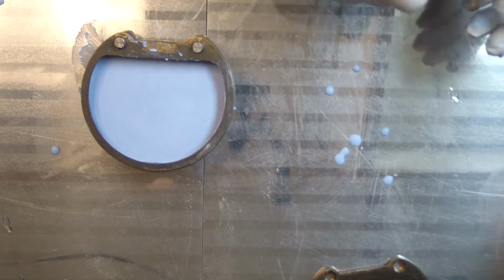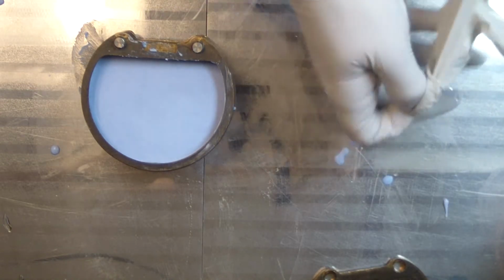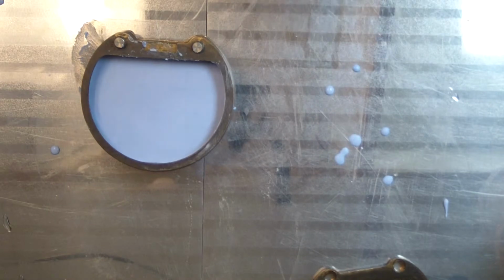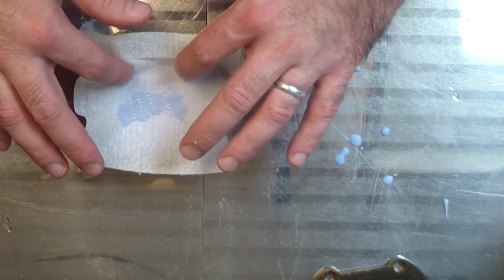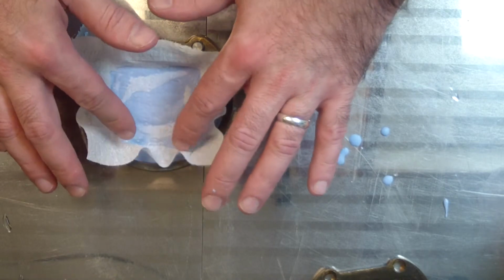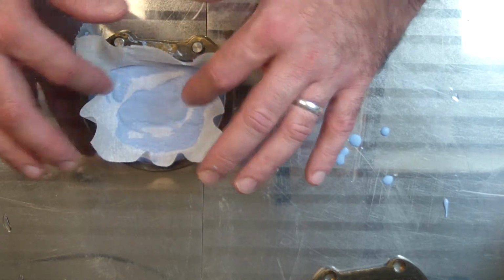You can either wait until this sets up and then apply separator and do your third pour, but what I will generally do is take a piece of tissue paper, single ply, either toilet paper or just regular tissue paper. This is single ply toilet paper. Just lay that right on top. Gently, you don't want to disturb too much.